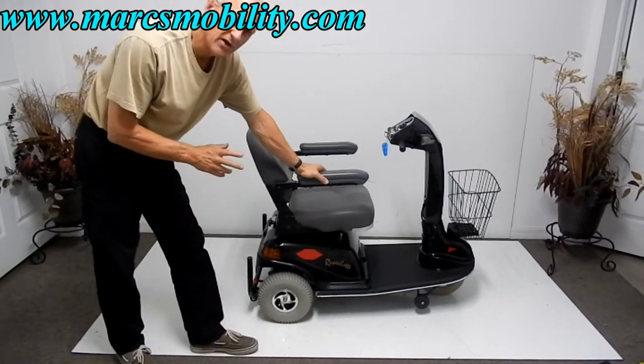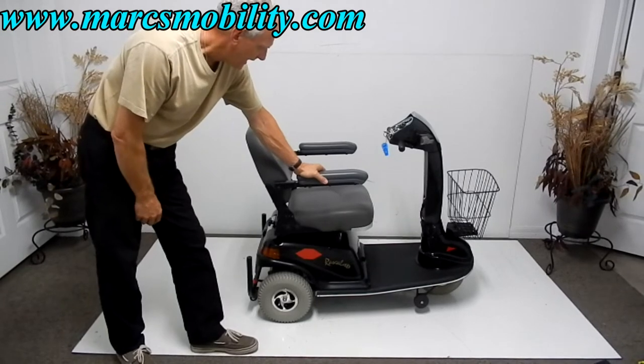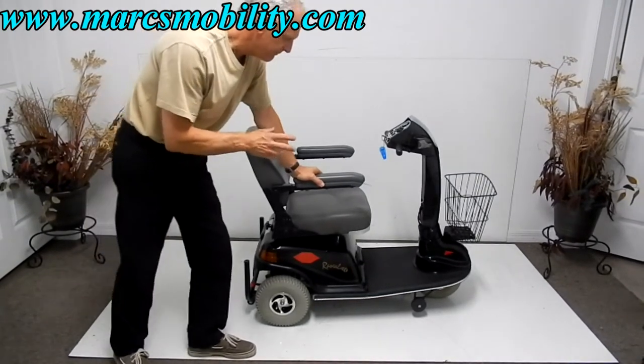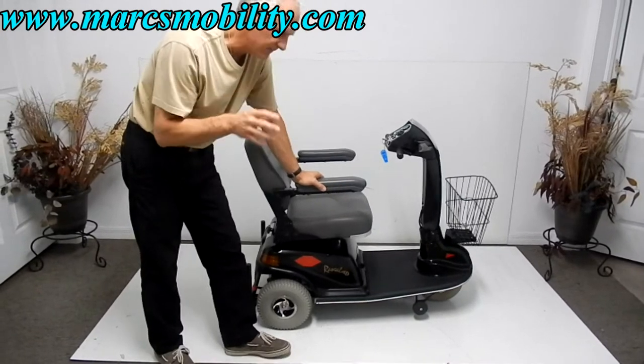This is a Raskol 600 three-wheel mobility scooter. This company made out and sold thousands of these, and this one also has a seat lift.